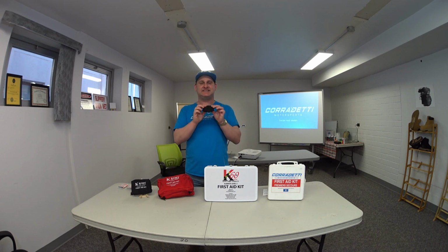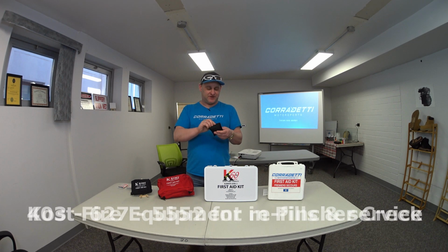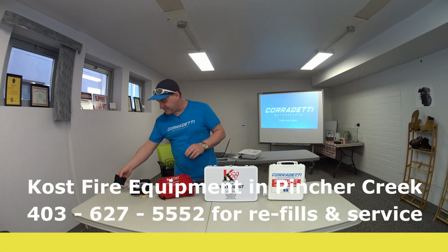However, like I said before, everything contained in this kit is a one and done, meaning you use it once, you toss it away, and you replenish it. However, the items contained in here are pretty easy to find and to replenish.